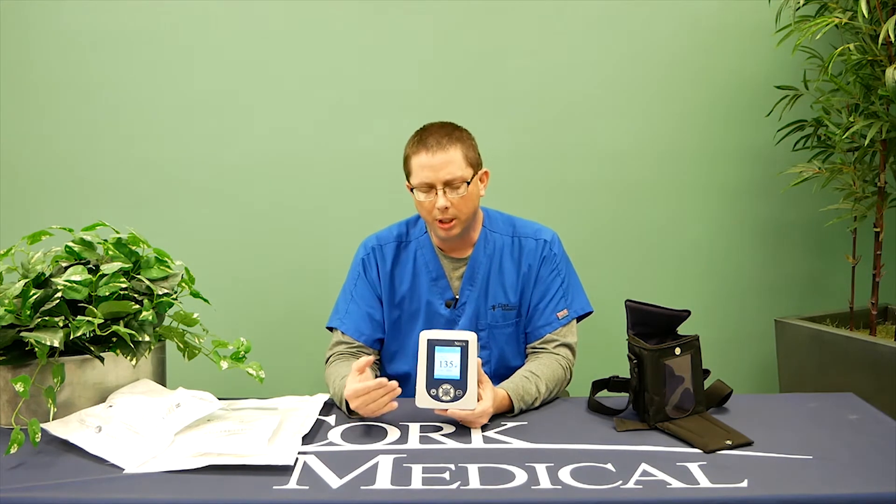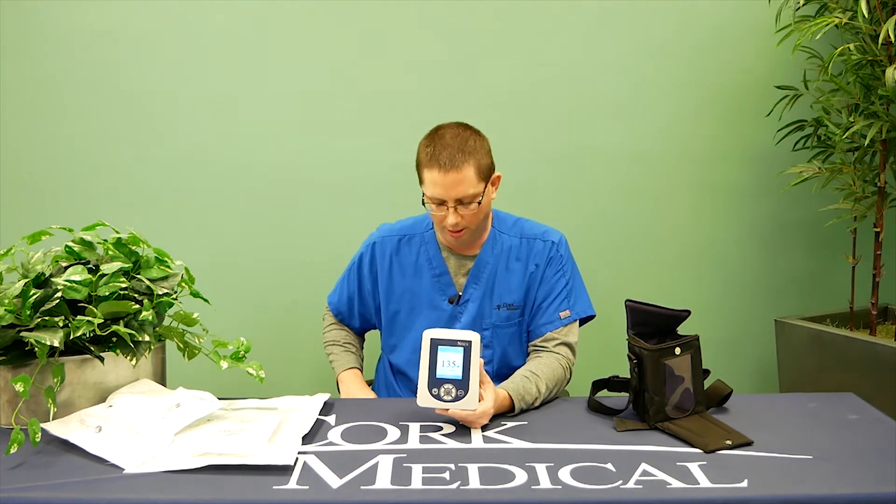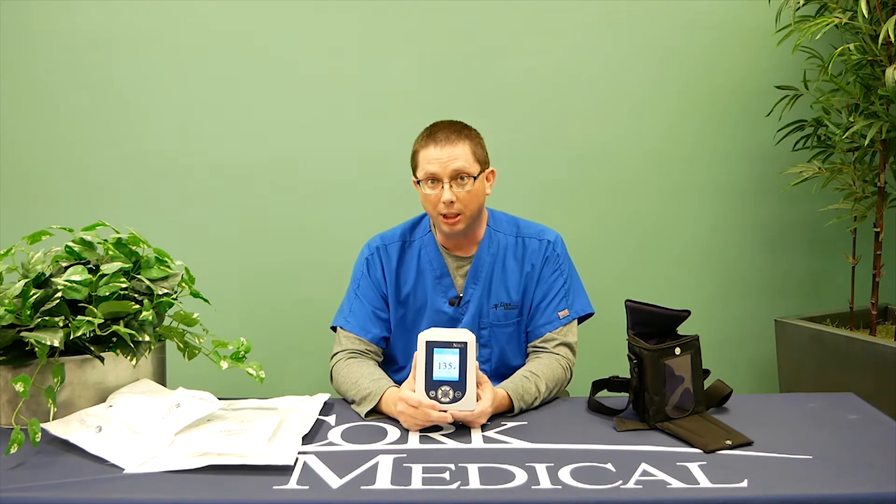While this pump is operating, if there are no visible or audible alarms on the screen, the pump is functioning exactly how it's intended to function. One nice thing about this pump is that if there is an alarm condition, the pump will explain to you why it is alarming, and then immediately after that, a set of troubleshooting guides will come up and help you troubleshoot how to fix that problem.